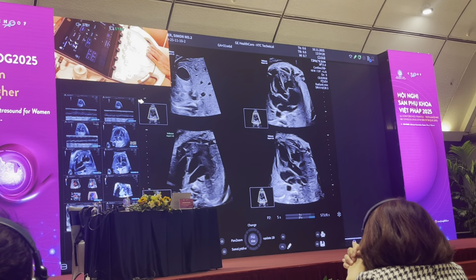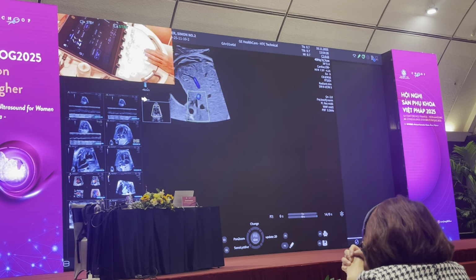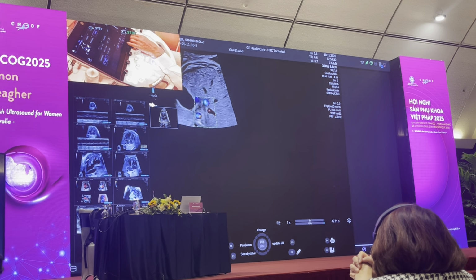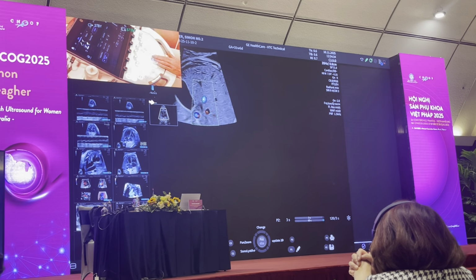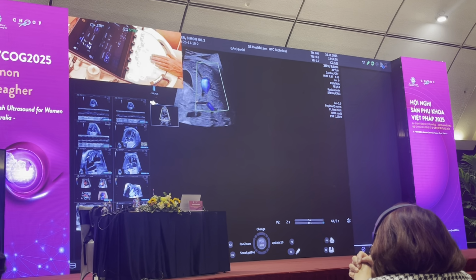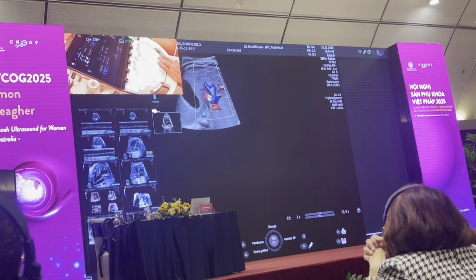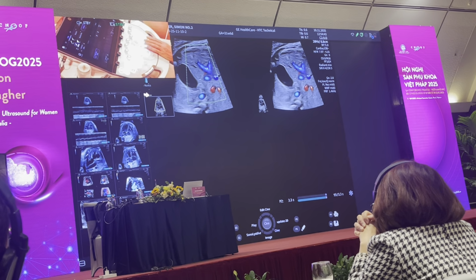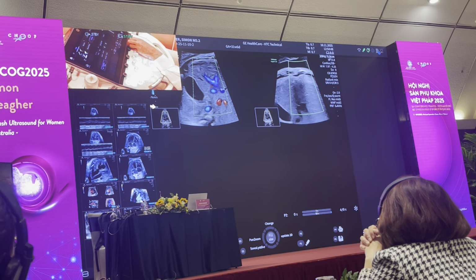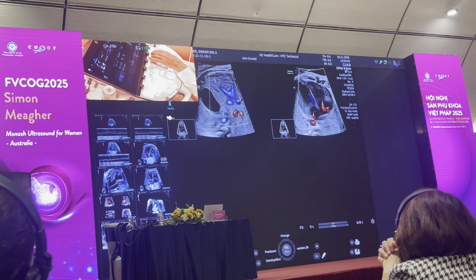And you can repeat the exact same exercise with color, and do the whole thing, the aorta and IVC, and then with PRF. You're demonstrating your aorta, your IVC. You're demonstrating your intrahepatic vein coming in and sweeping away from the stomach, if there's not a persistent right umbilical vein. And once you've got the image of that in the aorta and IVC, you then increase your PRF to 76 centimeters a second. In the four-chamber view, you show the cardiomegaly.